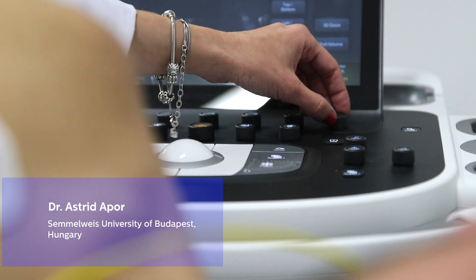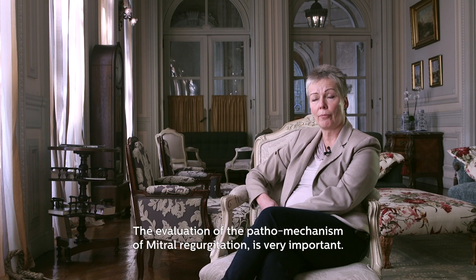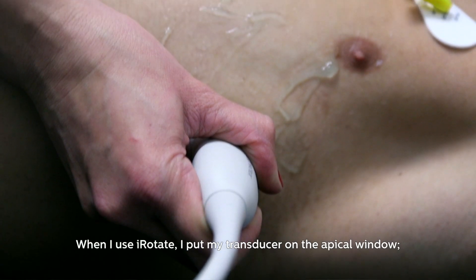I am Dr. Astrid Apor, working at Semmelweis University, Budapest. The evaluation of the pathomechanism of mitral regurgitation is very important. So I use iRotate.